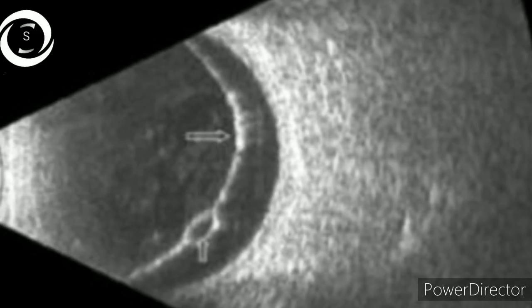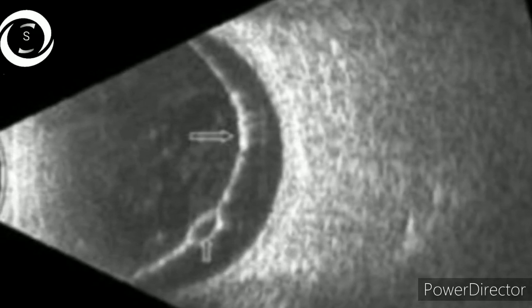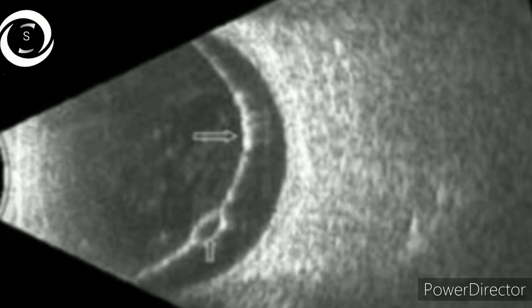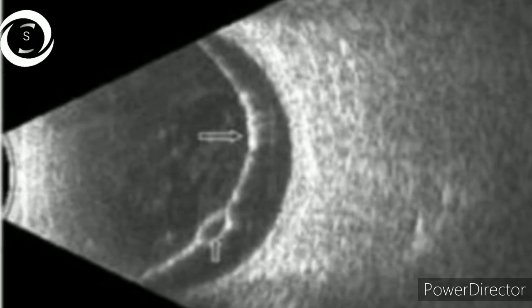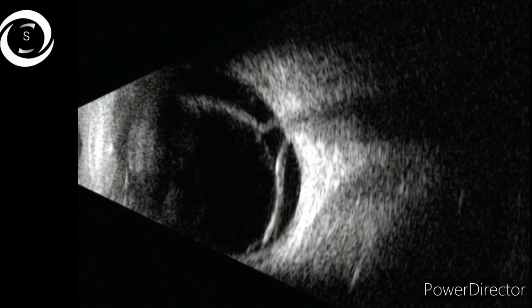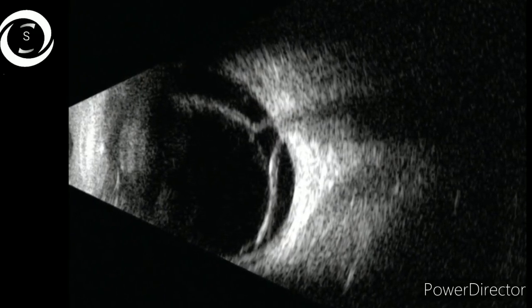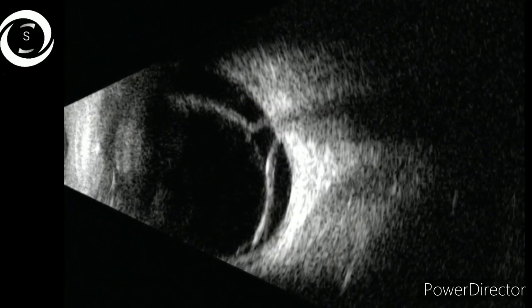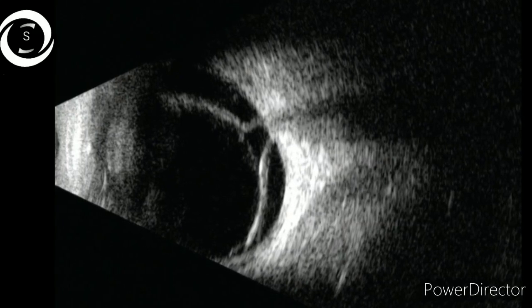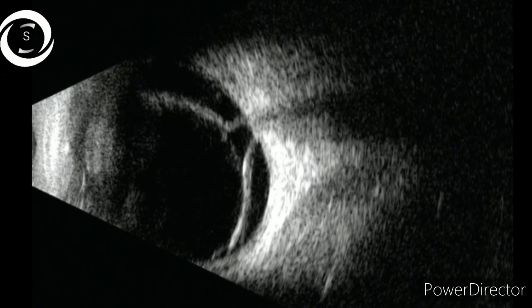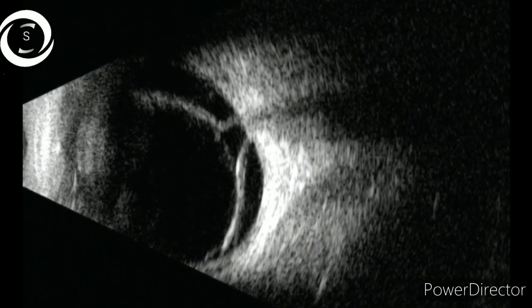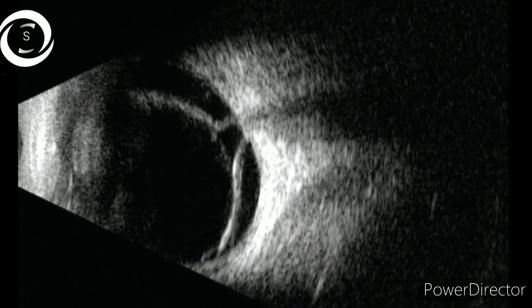The ninth B scan shows hypoechoic retinal cysts. In all retinal detachments, the surface is hyperechoic and the interior is hypoechoic. The tenth B scan clearly shows that the retinal detachment is attached to the sides of the optic disc and not over it — that is an important differentiating point from PVD.